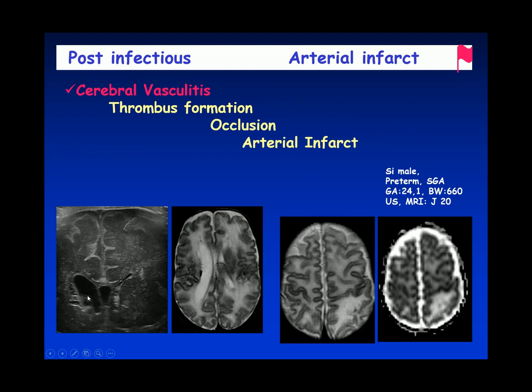And I was doing this examination, and I was very happy to follow up this baby, and I said, okay, this is a baby with the typical complication of intraventricular hemorrhage, a venous infarct, and I was very happy with my diagnosis. And I had the clinician behind my back, because in Greece, either you have the parents behind your back when you are doing ultrasound, or the clinician.